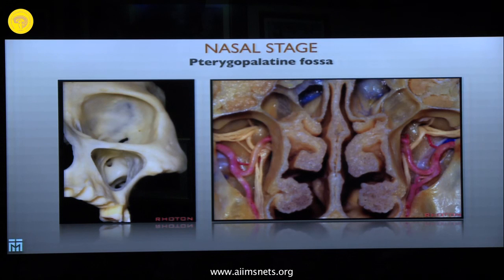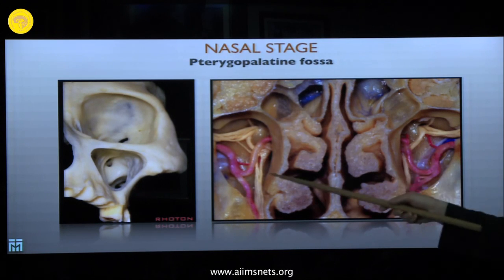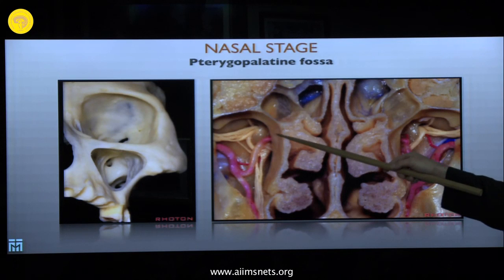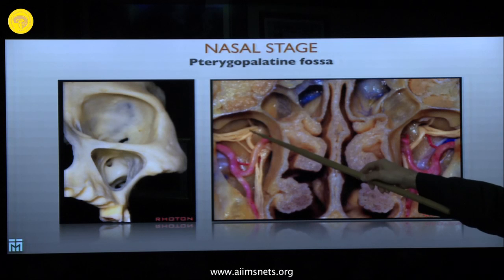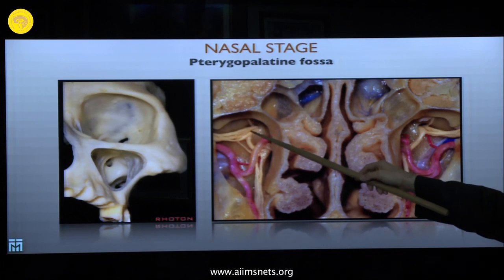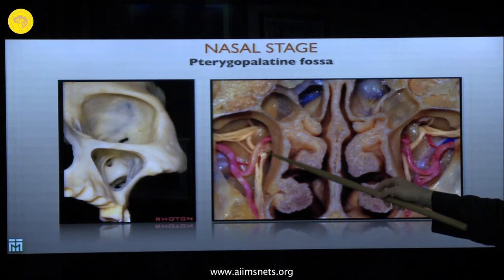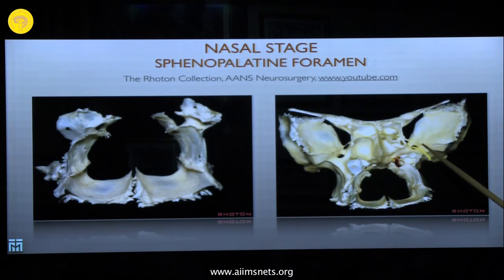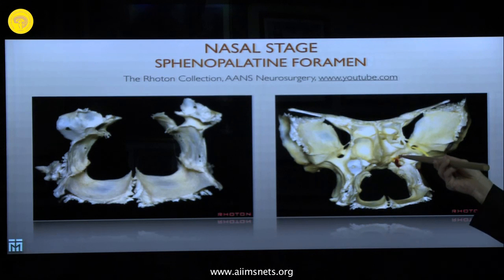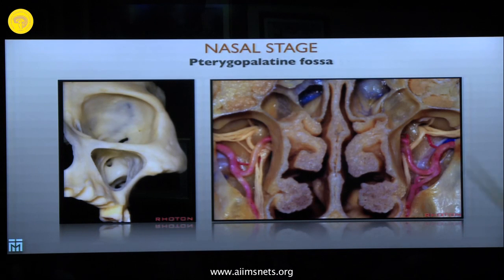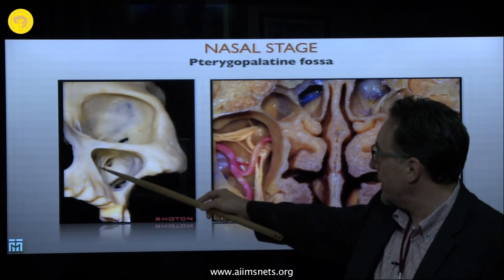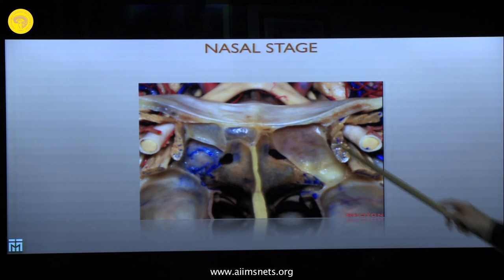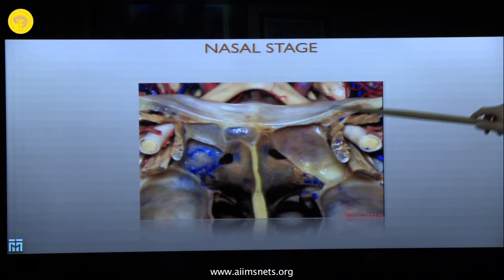The sphenopalatine foramen opens into the pterygopalatine fossa, which contains the maxillary artery and its terminal branch — the sphenopalatine artery. Also visible are foramen rotundum with the second division of the trigeminal nerve, the pterygopalatine ganglion connected to the vidian nerve, and the vidian nerve itself. The pterygopalatine fossa is reached by removing the posterior wall of the maxillary sinus. You can again identify foramen rotundum, the anterior wall of the sphenoid sinus, and the ethmoid air cells with their connection to the ethmoid bone.